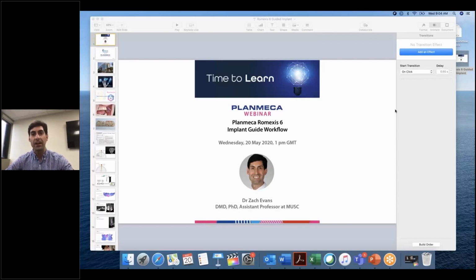So we've been using some early versions of Romexis 6 for, oh gosh, a little over a year. And I'd like to share our experience using that, but also give you hopefully some guidance on things that we've done to be more successful doing guided implant surgery in my practice, but also when I'm teaching students and residents, and definitely learned a lot from there. So again, thanks a lot for hanging out this morning, and let's do it.